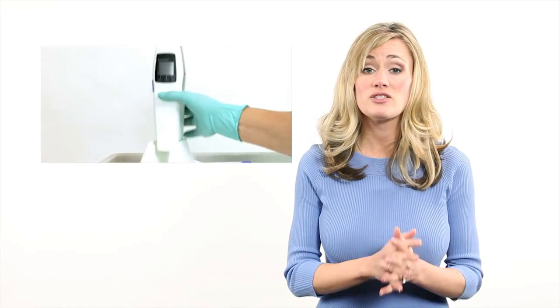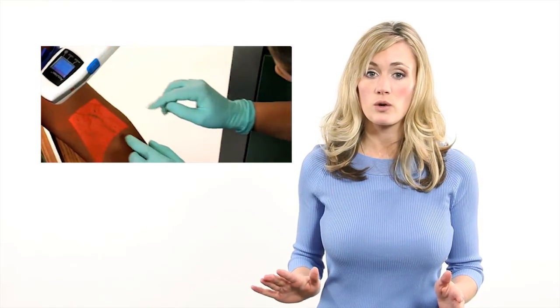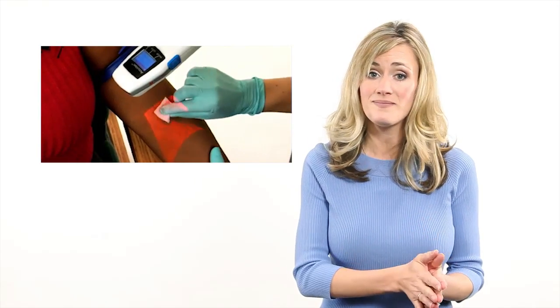A nurse can use the device by holding it over the skin. The veins are instantly highlighted and appear clearly on the surface. Hemoglobin and protein found in blood absorbs infrared light so the veins show up as dark lines on the otherwise red patch of skin. This great piece of engineering work will surely improve the getting a needle experience for both the patient and the healthcare practitioner.